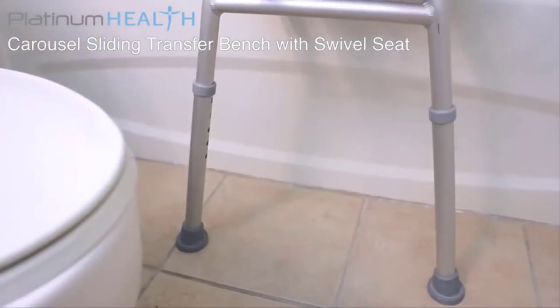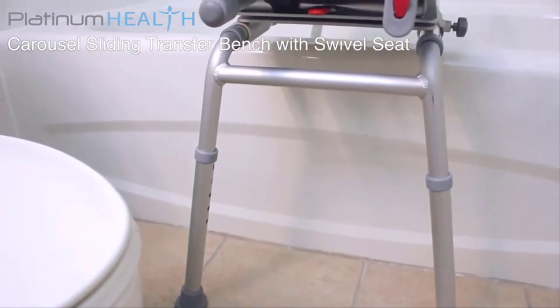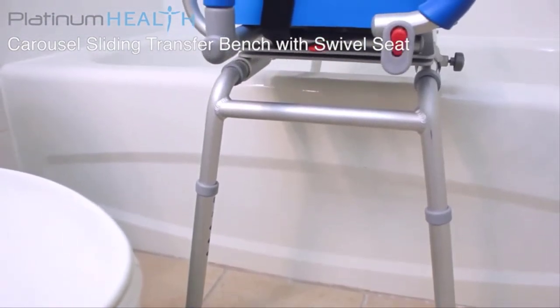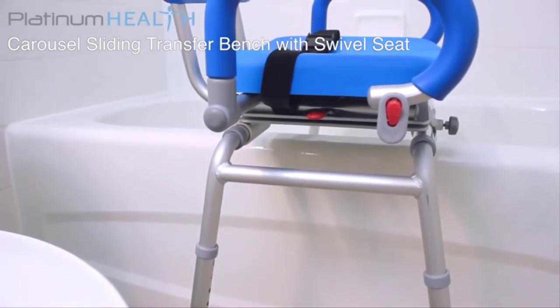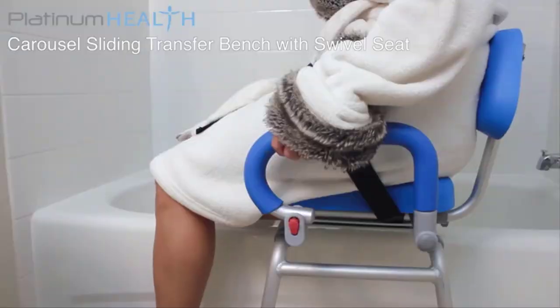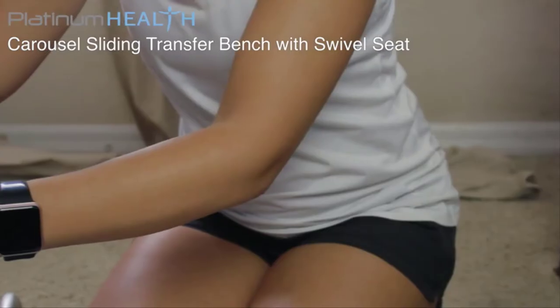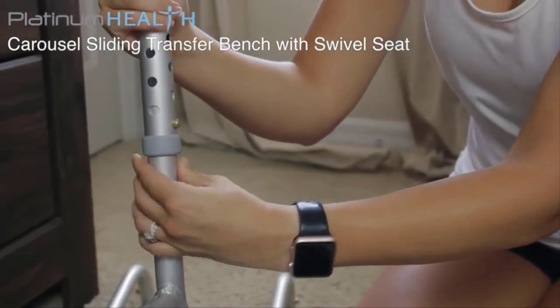The Carousel's space-saving design allows it to easily integrate with most tubs and showers. The adjustable height legs mean the seat height can be perfectly customized to the needs of the user. It is completely reversible and will work for both right side and left side access. The simple, tool-less assembly means the Carousel can be completely set up in less than five minutes.